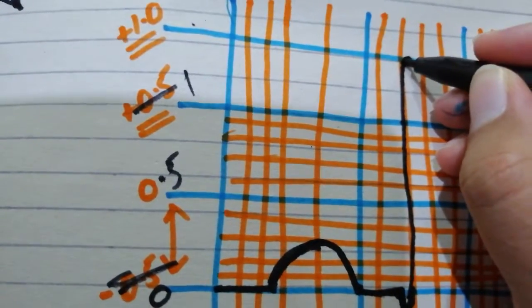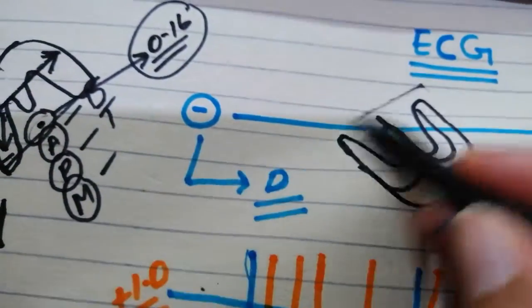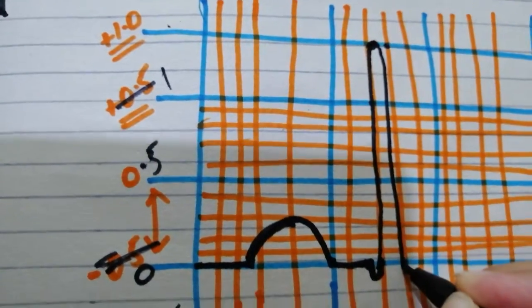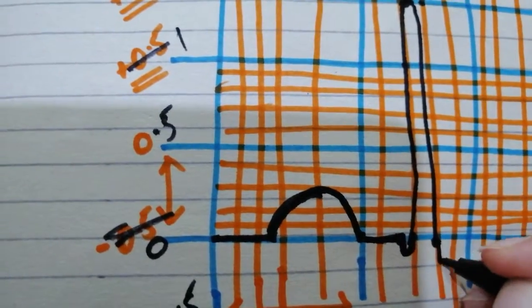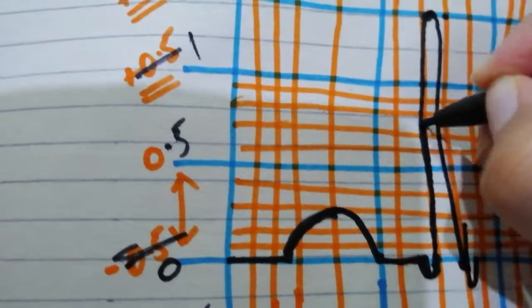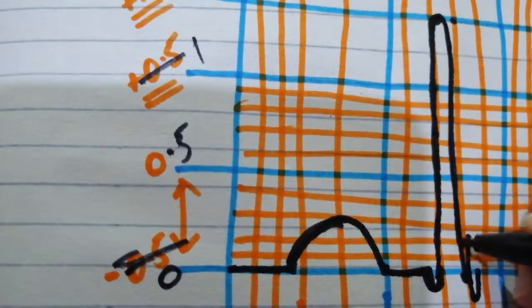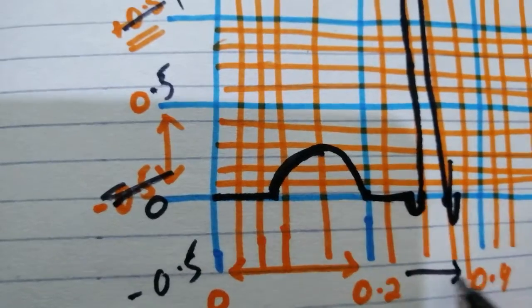So the R wave is representing the depolarization of most of the ventricles, especially the apex, all of the ventricles with the exception of the base. And the base is this part over here, and the last bit to receive the depolarizing signal. So then we have Q, R, and S. Now S is the one that is representing the depolarization of the base, and this is again negative. Now this is representing the whole of the depolarization of the ventricles, this QRS complex.